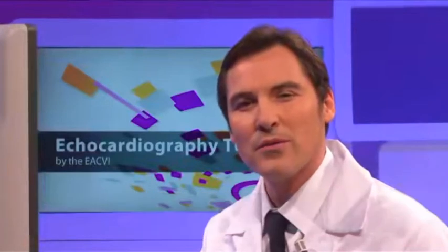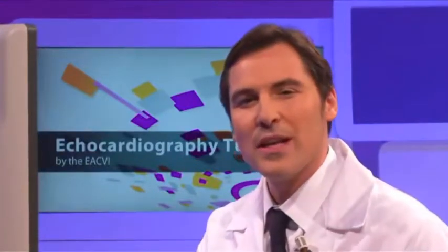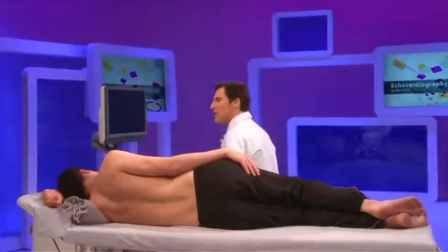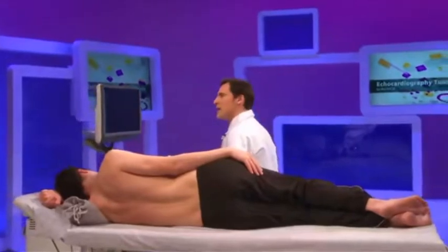So during the next few minutes, I will show you the key features that should be recorded in a patient with a primary mitral regurgitation related to degenerative mitral regurg. So we will start first by assessing the mitral valve morphology. After that, we will evaluate the severity of the mitral regurg. And finally, we will assess the consequences of the mitral regurg on the left ventricle. Let us start first with the mitral valve morphology.